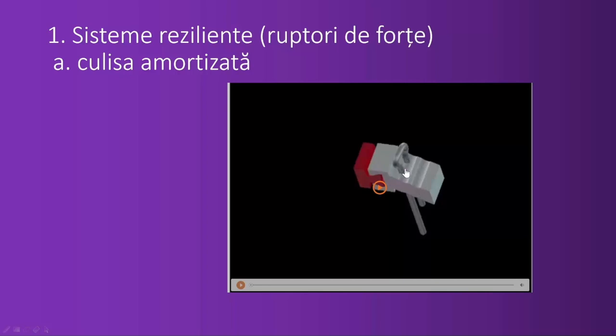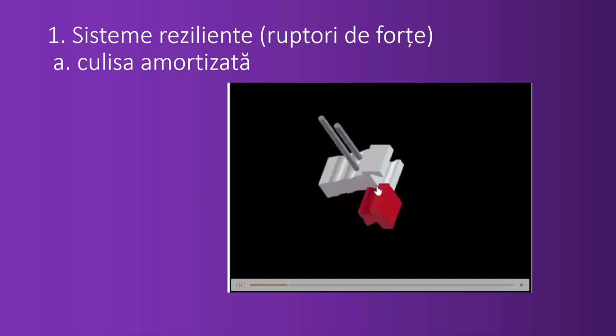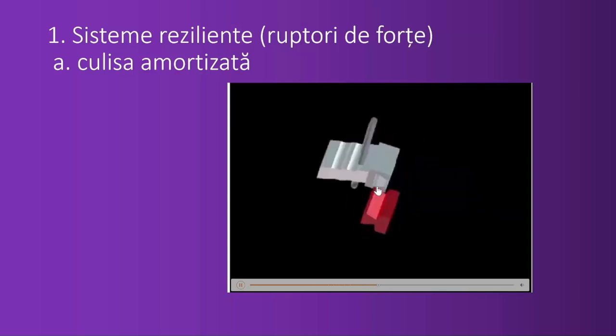See, this metal part holds the pin and the spring together to press against this coulisse, this vertical solution. Matrix and patrix, that's how they work. You see the pin, that round thing inside, and this pin is pressed on by a spring that is inside the mobile part.